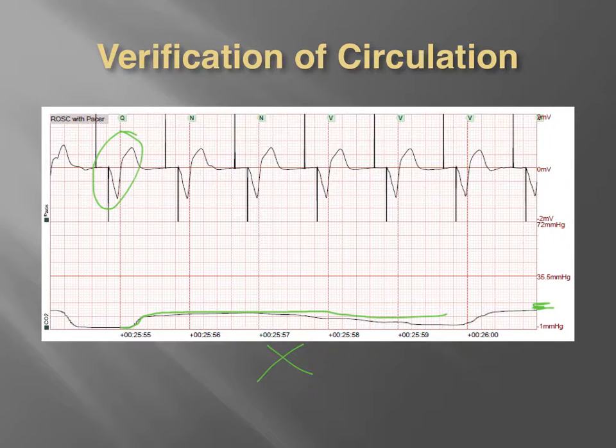So as we're getting this patient packaged, I also called back on med radio and described that same exact situation, and said we wanted to monitor her for a few more moments before we transported and see how well she held up. Hospital was okay with that, and we moved on with still getting ready to package the patient, but also monitoring our situation, being that we weren't confident that she was going to maintain this at all. And partly that was because of this reading here. That's such a low reading, and sometimes people just die, and that was going to be the case with this lady, as we can show you in the next slides.